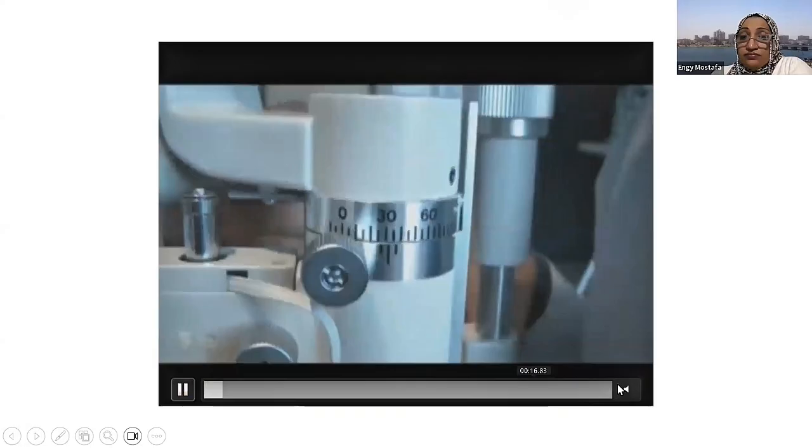And increase the magnification, and preferably over the pupil, also to get the blackish background. And here's the first Purkinje image, and then we are looking at the back of this light you are using. Here's the endothelial surface. Some people say, and of course you have to have high magnification, we are looking at the back of this optical section.